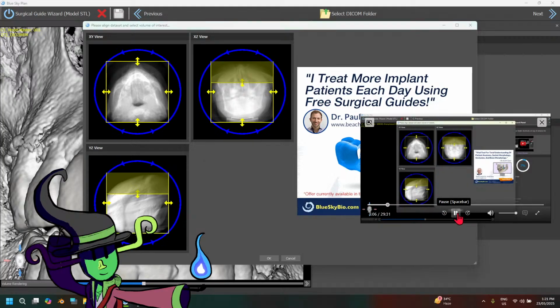It changes my treatment plan, and the bigger the field of view that you deal with, the more computing power your computer's going to need to have. So yeah, I get that. Basically, even up to now, we still need to manage the amount of computing power that our computers get with these 3D models. If you're a bit limited on your RAM and your video card, don't overcomplicate this and give it tons and tons of data to crunch. Limit it down to the jaw that you're working.